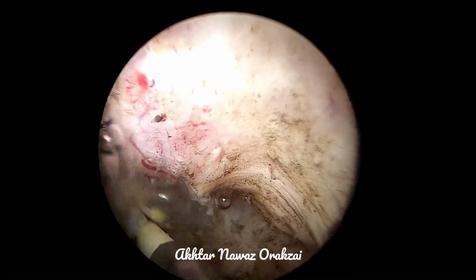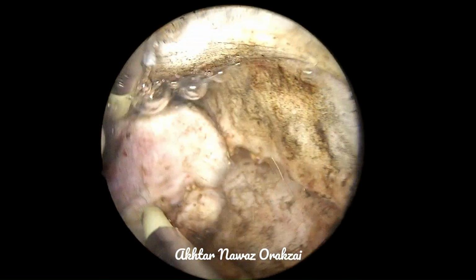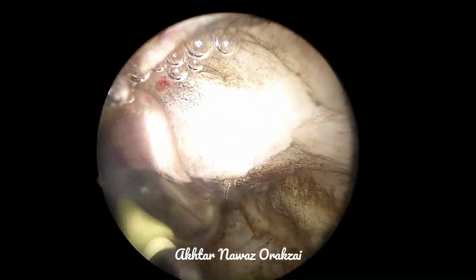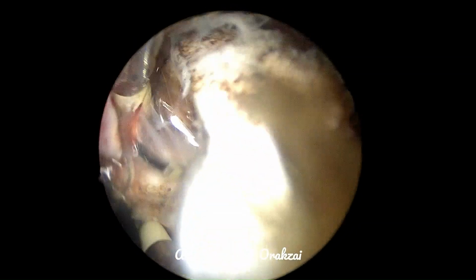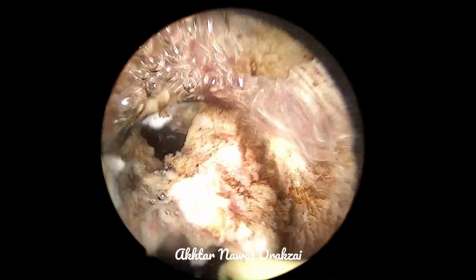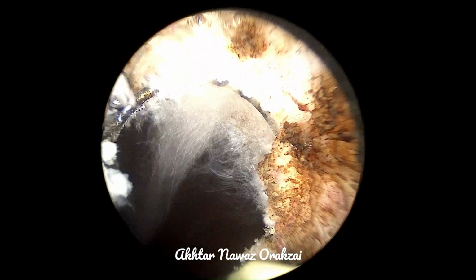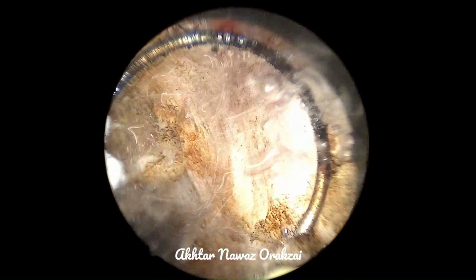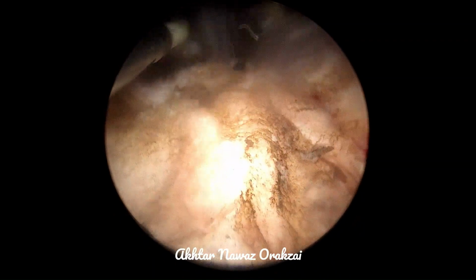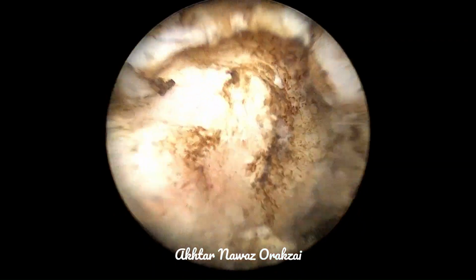Now you can see that as we are resecting more and more of the prostate, resecting one area leads to popping up of prostate from another area. So we resected the median lobe, and now we can see that the left lateral lobe is popping up again. When we resect the popped up left lobe, we will see that more of the median lobe will pop up. So we will resect that area too.